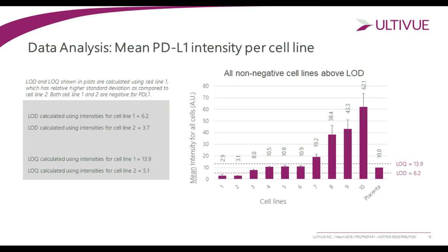The more we understand PD-L1 and its interactions within the tumor microenvironment, we find that the amount of PD-L1 and the type of cell it is on is becoming more and more important. So having an assay that is verging on quantification, by being able to set standard curves using types of controls like this, allows you to understand the lower limits of detection and how much PD-L1 may be important for a specific treatment protocol. And that becomes more important as we develop more immunotherapies and these types of personalized medicines that we're seeing in recent years.